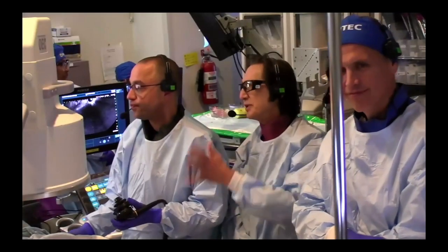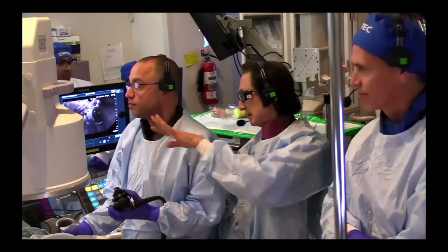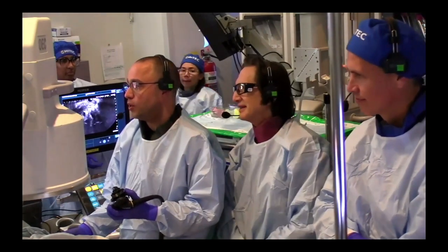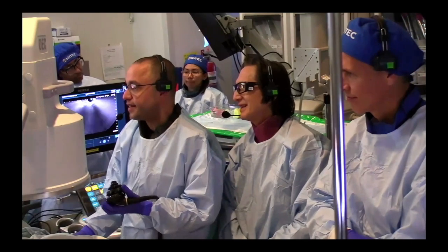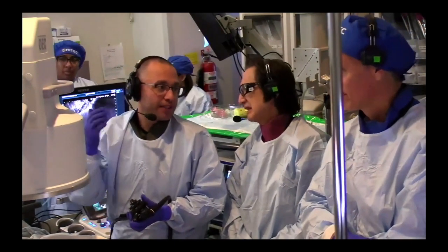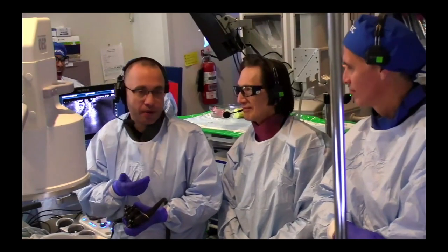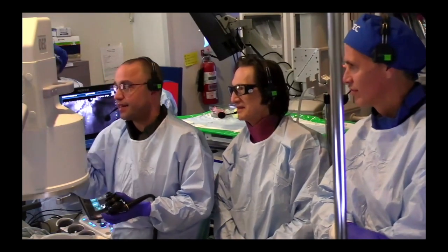And you agree there's no indication to dilate this, right? You leave it. You're not going to dilate. No, right. Just to be clear, the only time we dilate is walled-off necrosis that's infected. Immediate drainage and then necrosectomy. But other than that, let it dilate by itself.